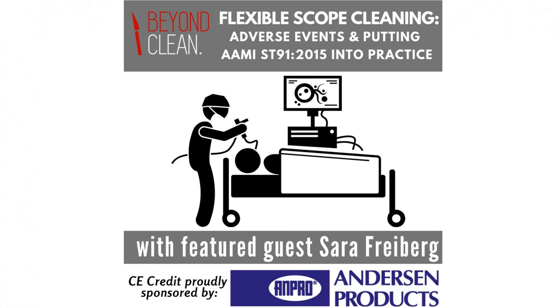So along those same lines, when you find a scope that is leaking, what do you do from that point forward? How do you clean that scope once you've found there's a big hole in it? So if the scope fails a leak test, it is important to visually observe the area of damage. As an example, maybe the user has detected a small puncture within the bending section area, and the user sees a bubble or bubbles. It's very important that we share with staff to keep that endoscope connected to the leak tester, to keep that scope pressurized.